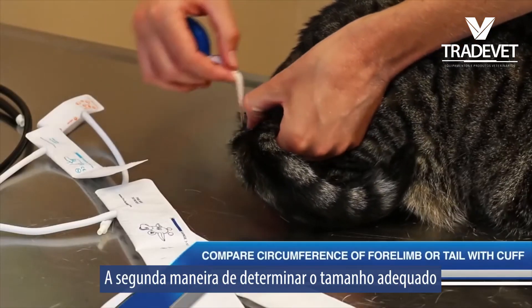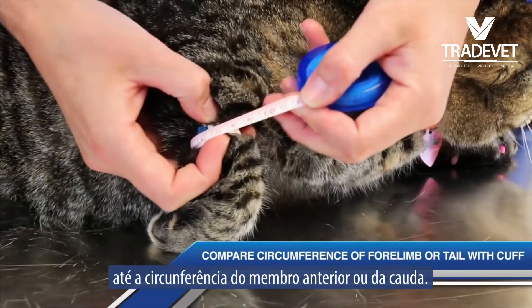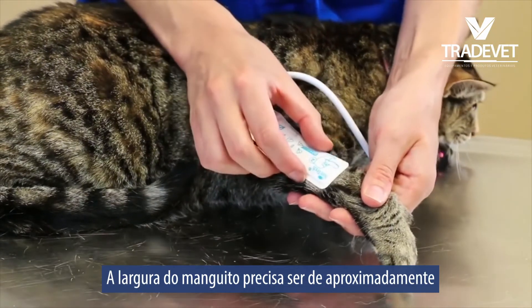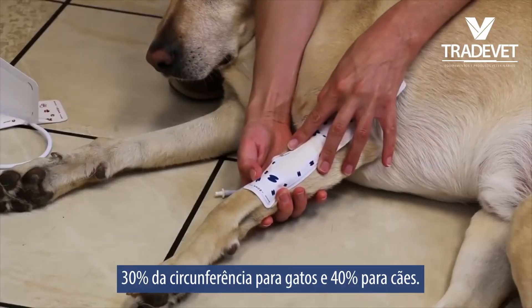The second way to determine the proper cuff size is to compare the width of the cuff to the circumference of the forelimb or tail. The width of the cuff needs to be approximately 30% of the circumference for cats and 40% for dogs.